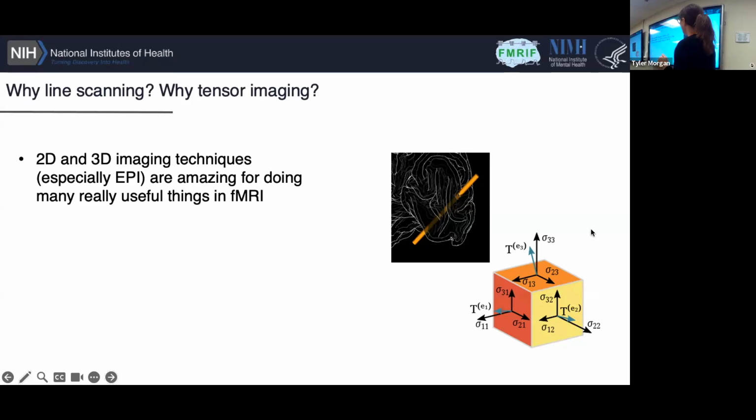Okay, we'll keep on. So most of what we've learned in the fMRI course so far has been about 2D and 3D applications. And this is an easy way for us to think about MRI because it's the anatomical units that we typically think of MRI in. So you can either have 2D imaging, which is essentially just a slice through a particular piece of brain, and then you try to image it over and over again, or you can try to do a volume, something like a 3-dimensional.